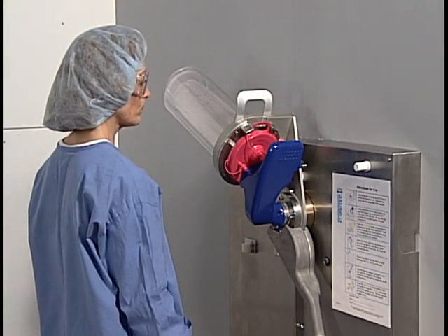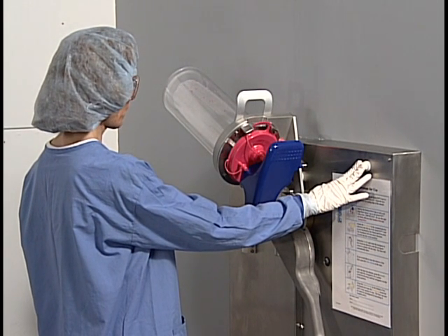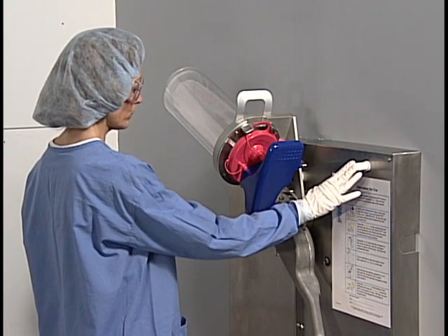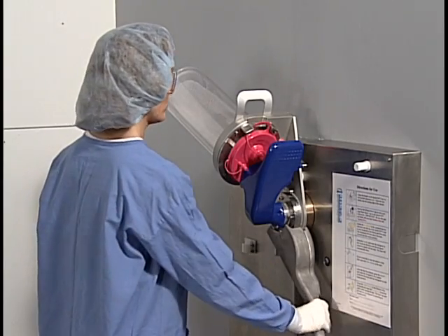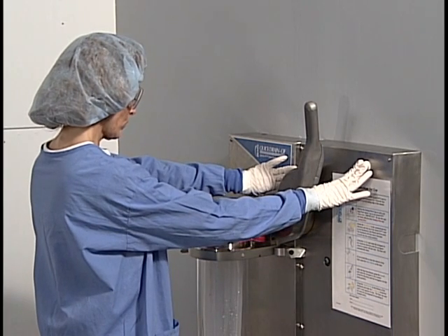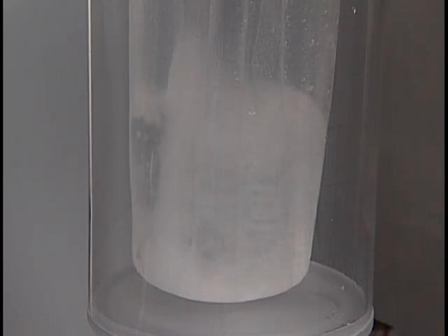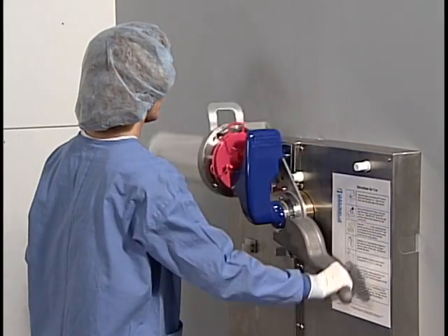After the liner is completely drained, you can rinse the inside by pressing the rinse button on the right. When the liner is completely drained, return the swing arm to the home position. If additional rinsing is required, you can fill the liner with water by pressing both rinse buttons simultaneously. After the liner is filled, drain it again.